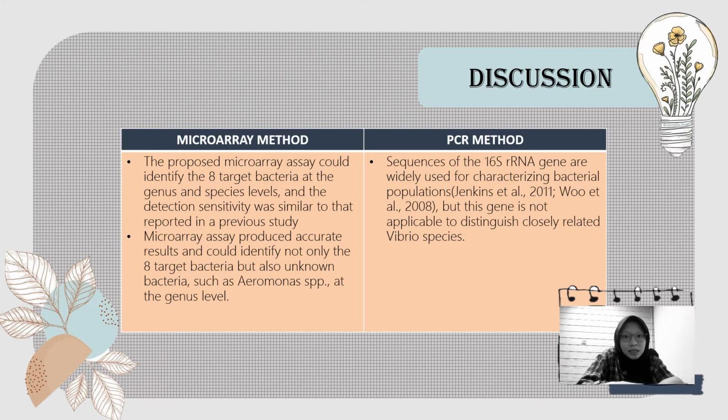The detection sensitivity for Vibrio anguillarum in fish blood is less than 100 colony forming units. Furthermore, the time required for pathogen detection in blood samples from diseased aquatic animals is less than 5 hours, which is more efficient than the PCR culture method.